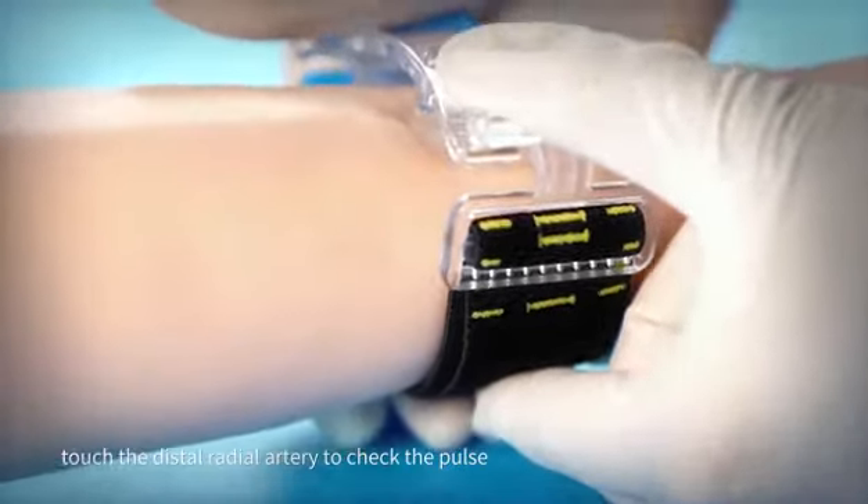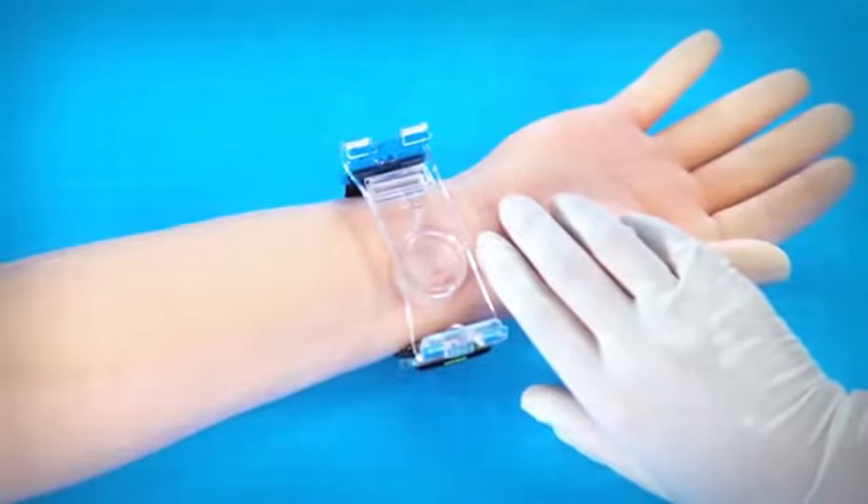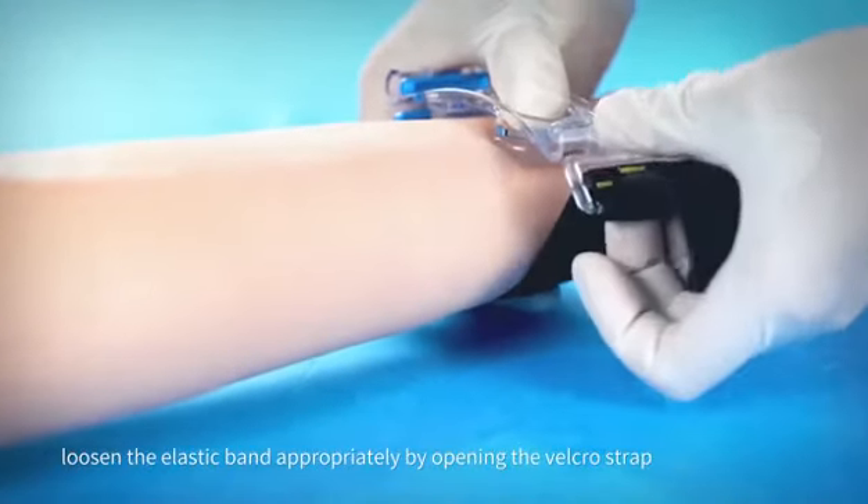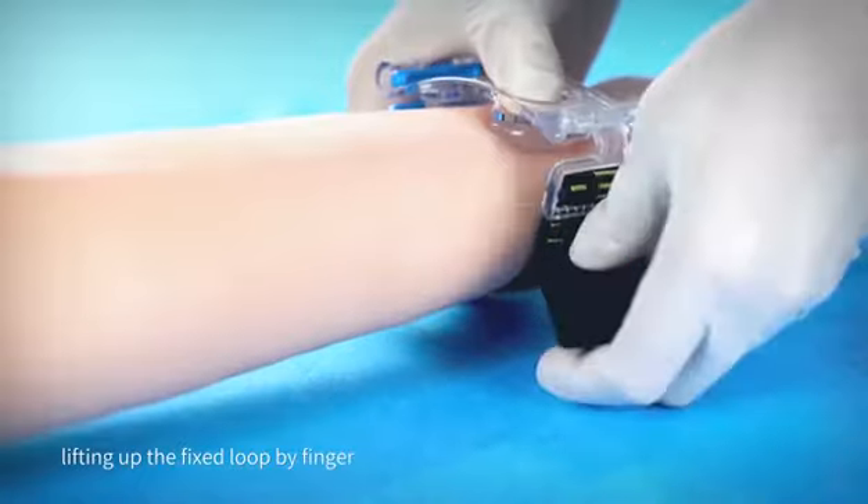Touch the distal radial artery to check the pulse. If there is no pulse or it is weak, loosen the elastic band appropriately by opening the Velcro strap and lifting up the fixed loop with a finger.